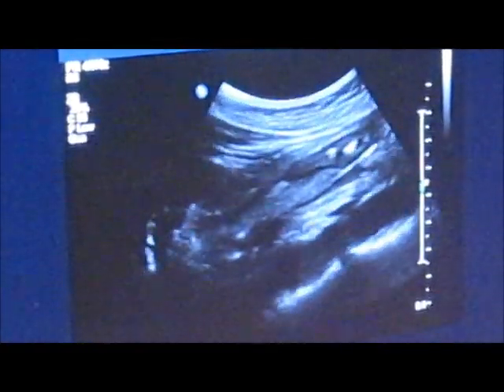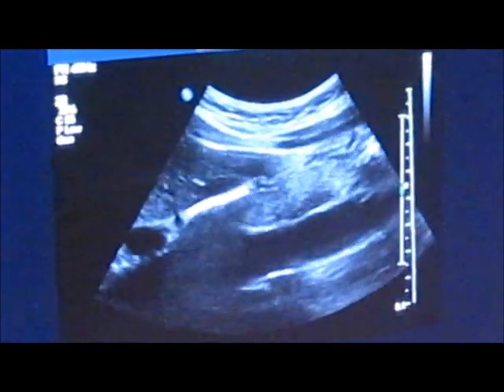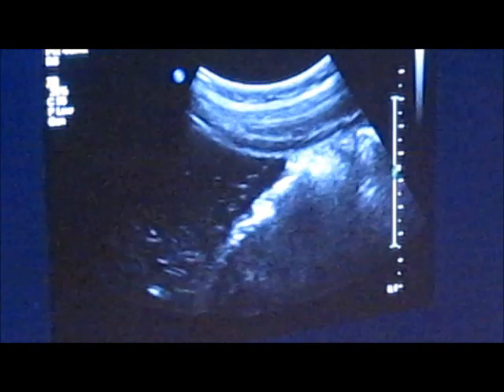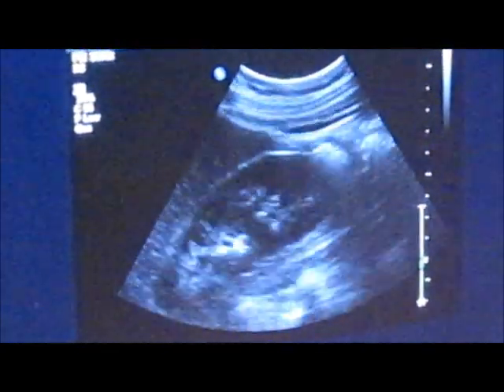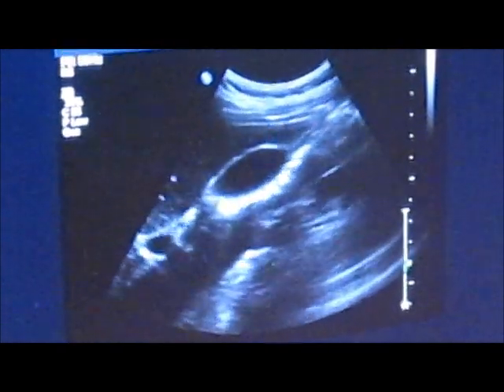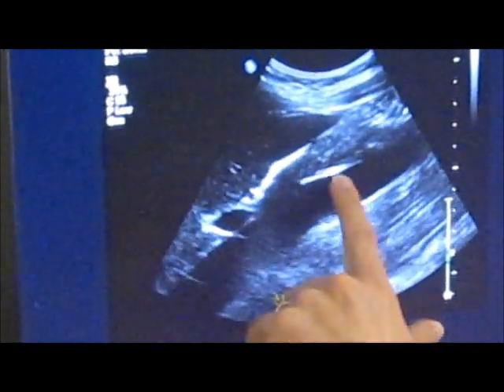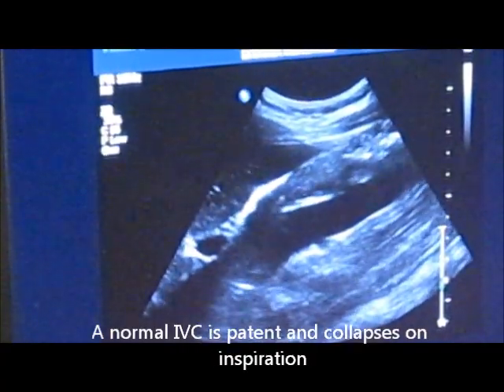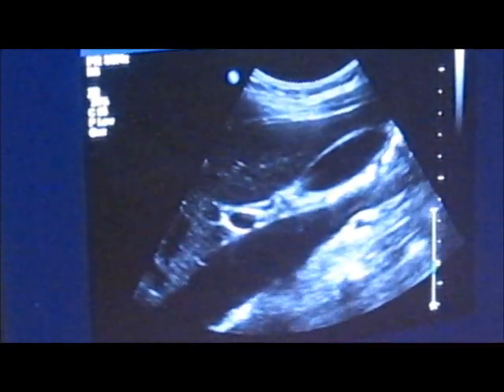The other big vessel in the abdomen is your IVC. It's one of the biggest veins. Brings all the blood back up towards the heart. If I can do a better picture. There we go. This one is dependent upon respirations. So it's moving, but it's because the patient is breathing. So if she takes a deep breath in, it'll collapse on its own. Breathe out. There you go.